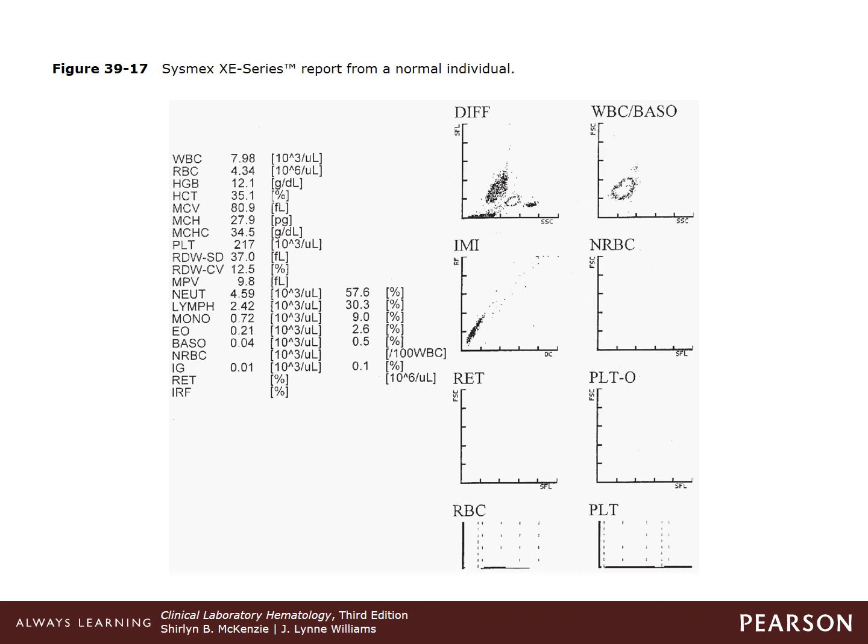Now, in the nucleated red blood cell channel, cells pass through here and are diluted. The red cells are lysed, and a fluorescent agent is added, which binds to the nucleus of the cells. The reagent only perforates the membranes of leukocytes, allowing the dye to enter the cell and bind to the intracytoplasmic organelles, but it does not alter the leukocyte's shape.